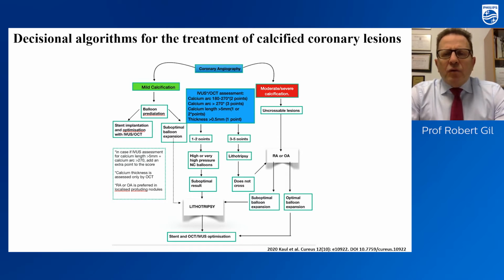So therefore, we know that we should search for calcifications in coronary bifurcations as well.